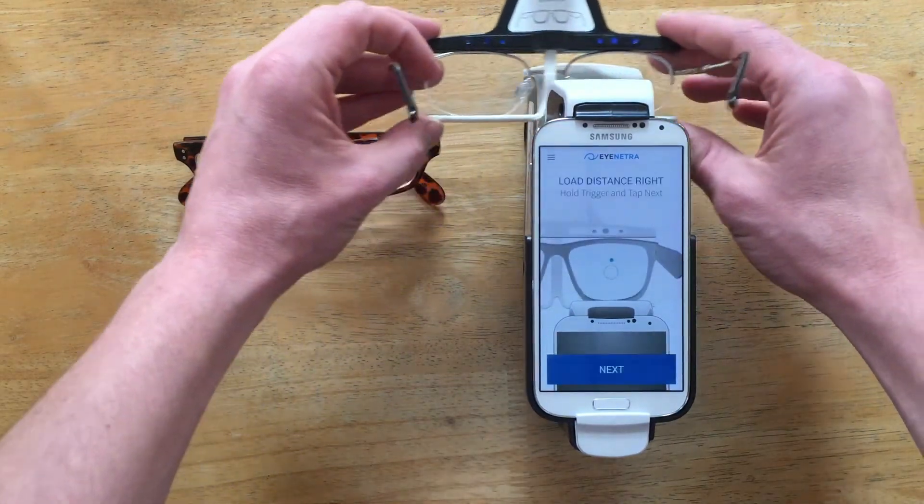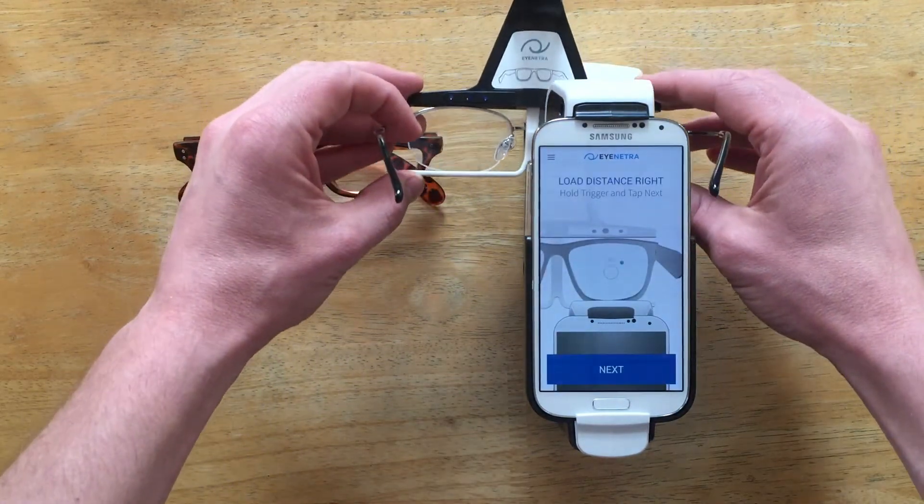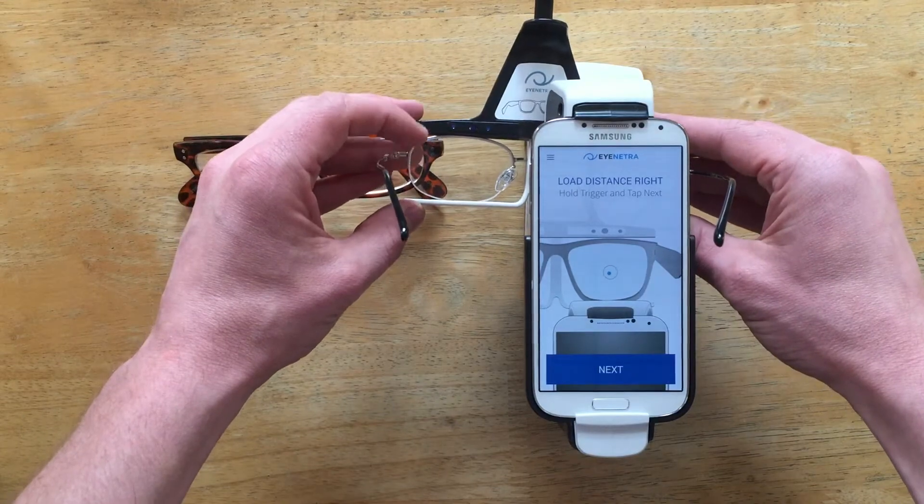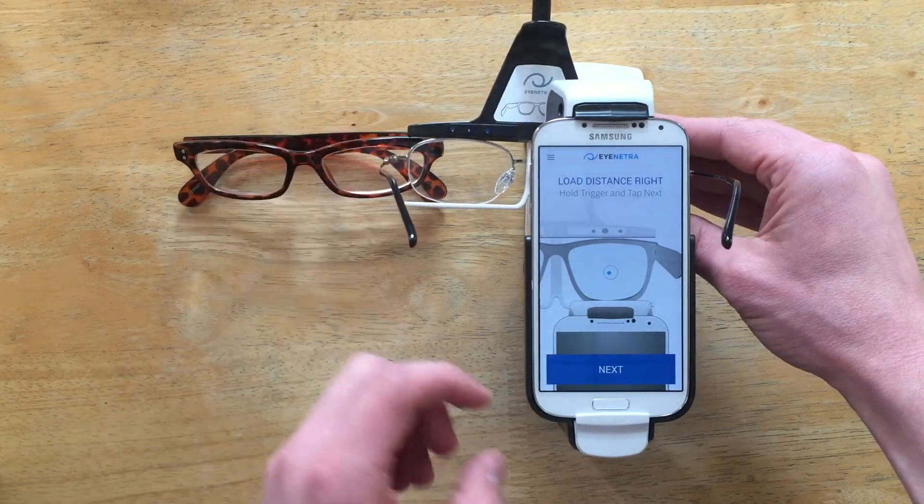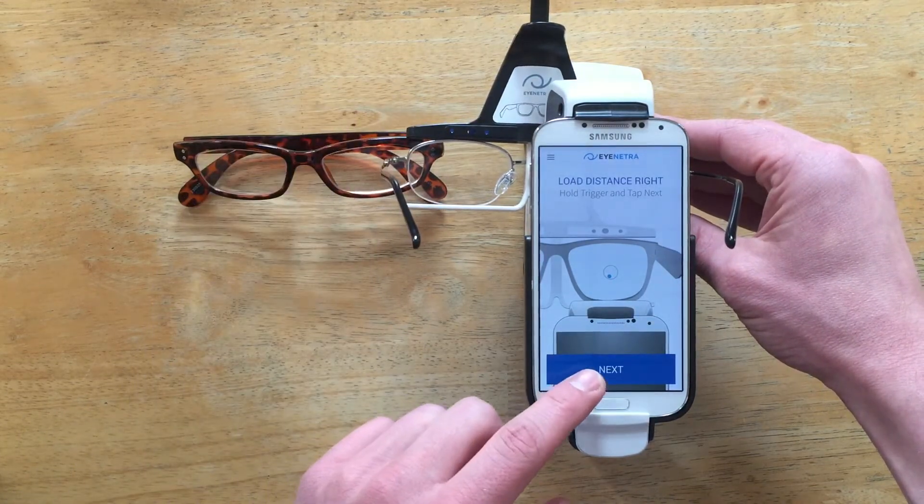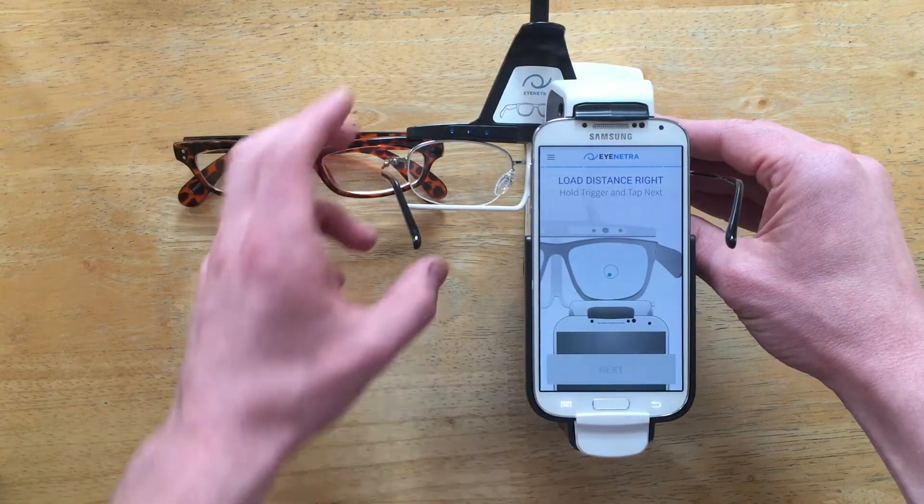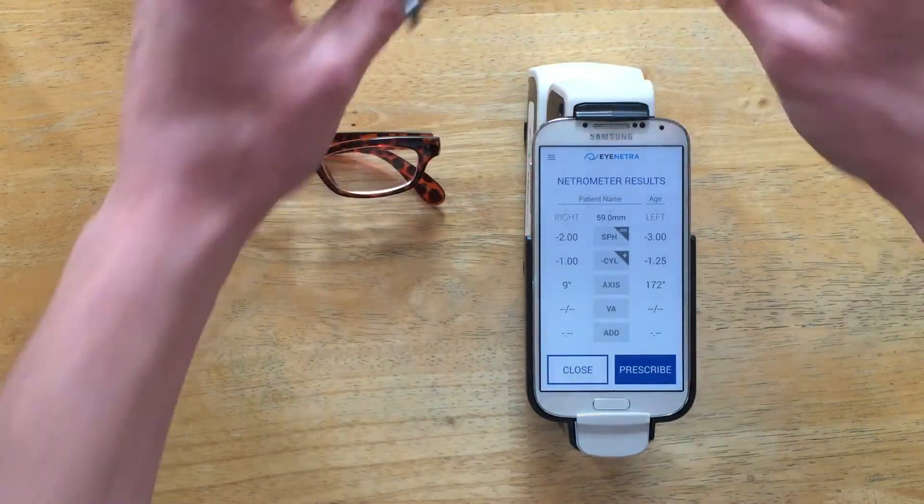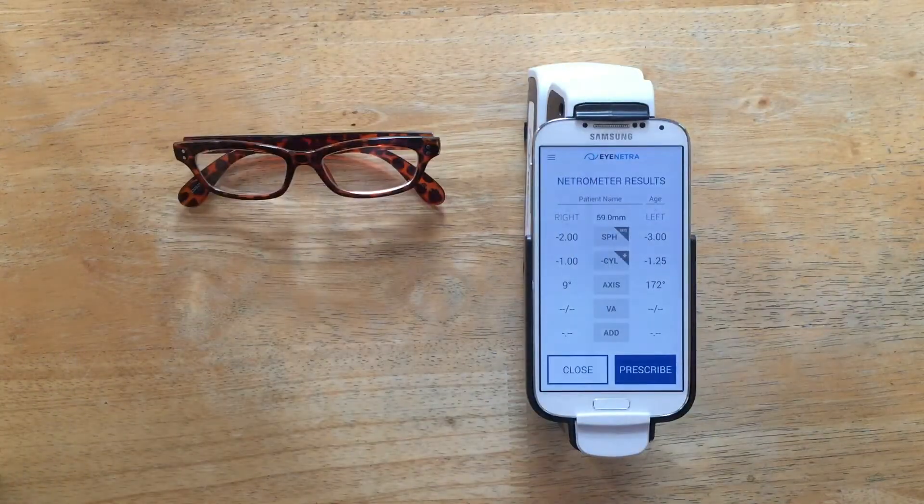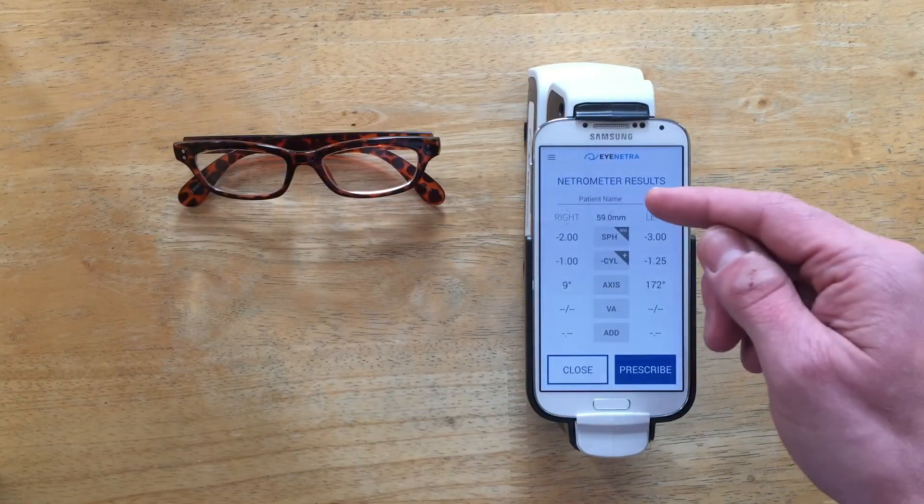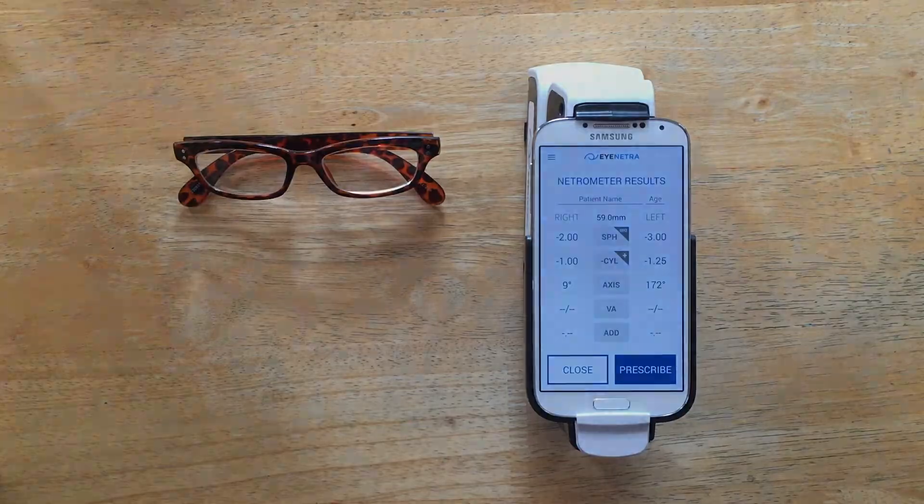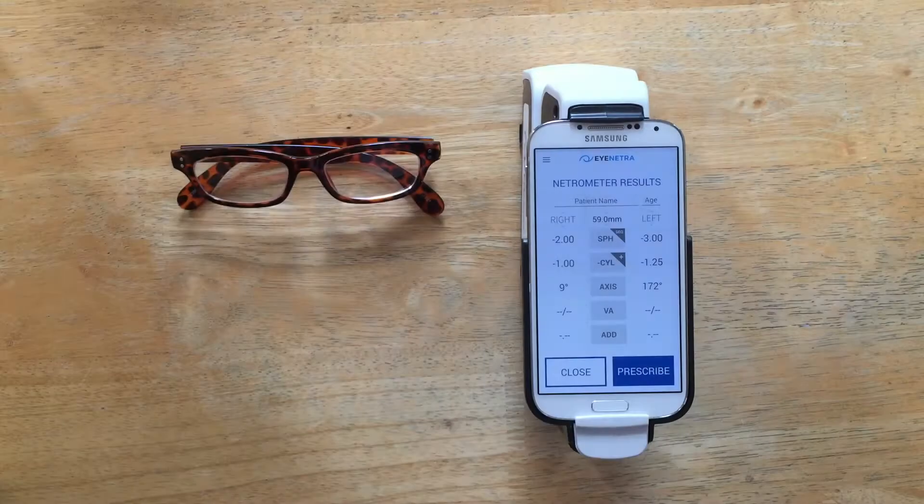And then repeat on the other side. Insert the right lens and tap Next. And there you have it. Now you see we have a PD measurement on our reading.